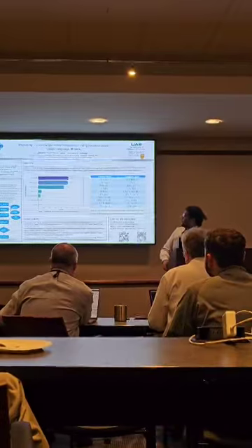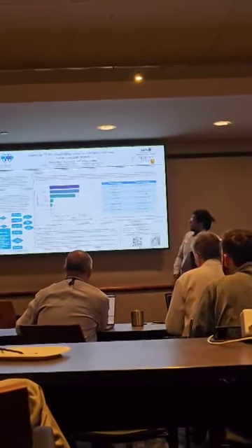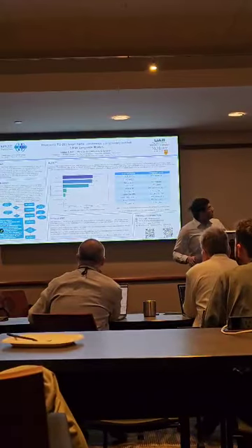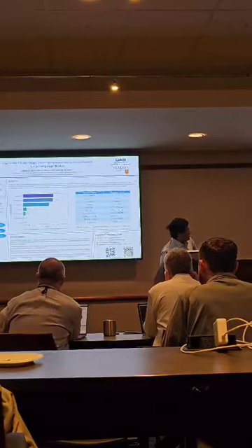So for us, consolidating and making sure that there's good agreement inter-physician and physicist and whoever else is on the clinical team, getting them to agree on a good name is difficult. So consolidating this using large language models is the output of this study.